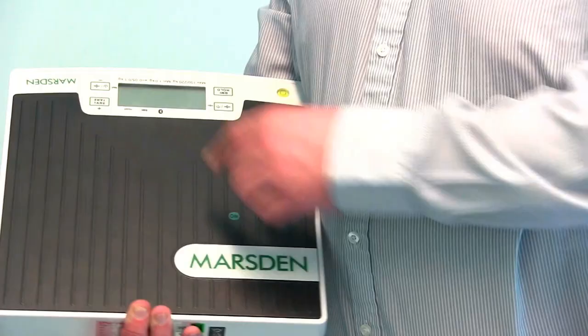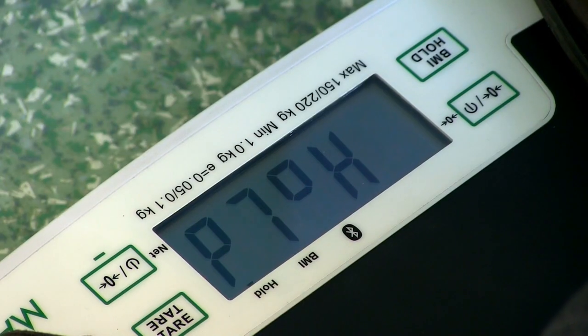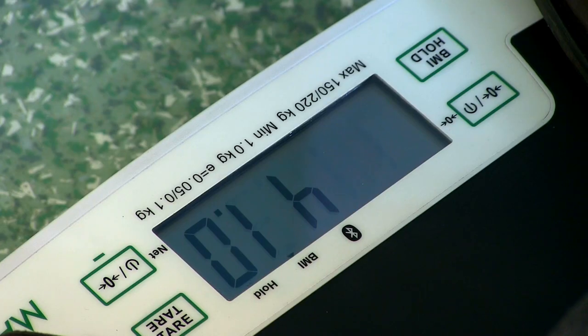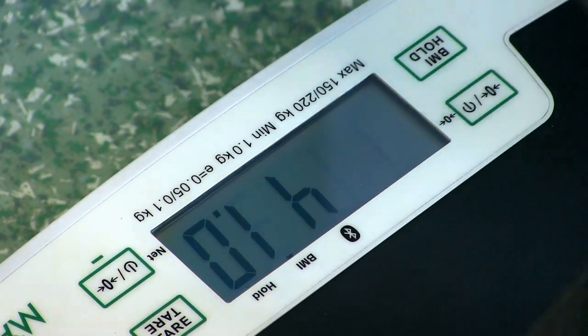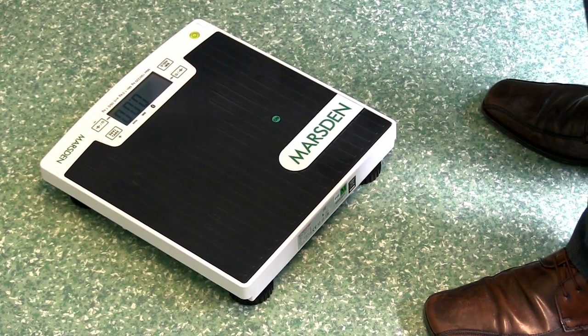Weight reading on the scale can be reversed. It has a tap on feature, hold weight feature, BMI function, and it also comes with a Bluetooth option for transferring the weight data to a central database via a PC, tablet or smartphone.